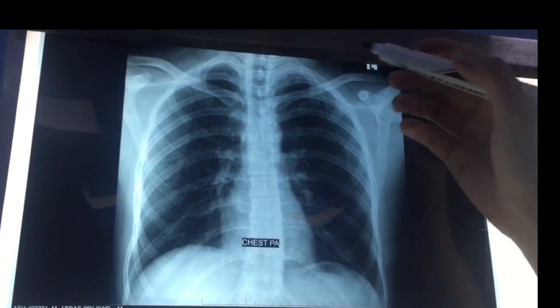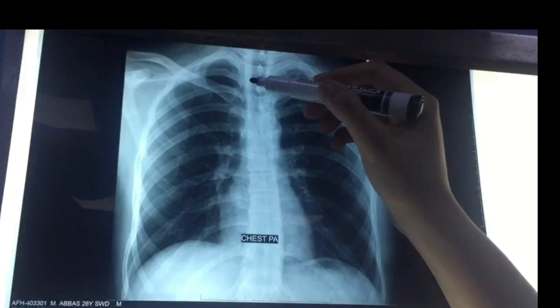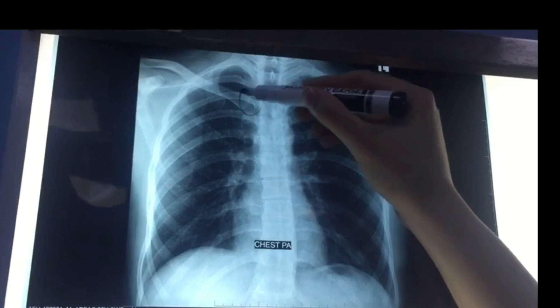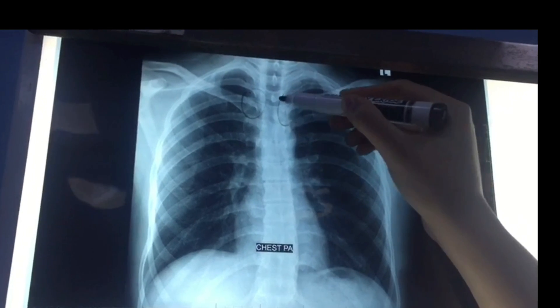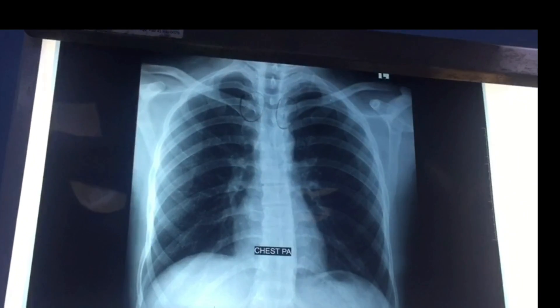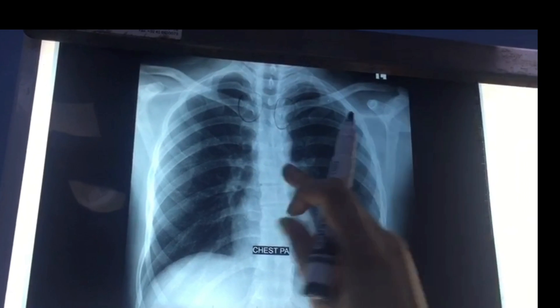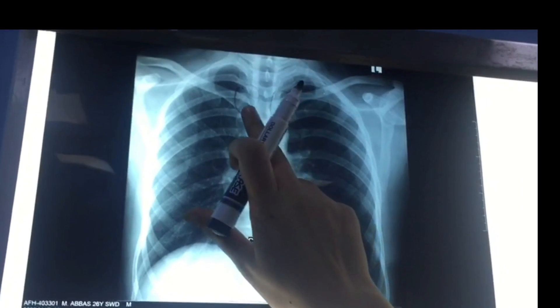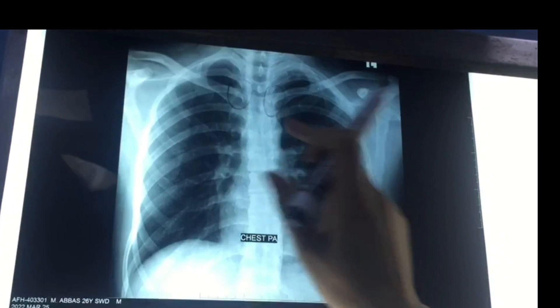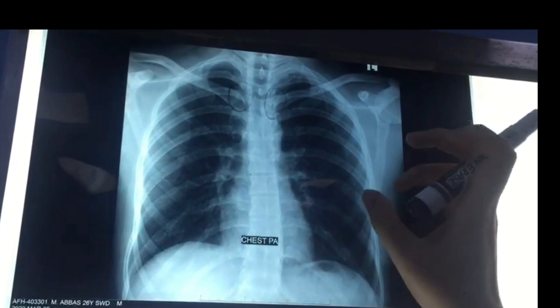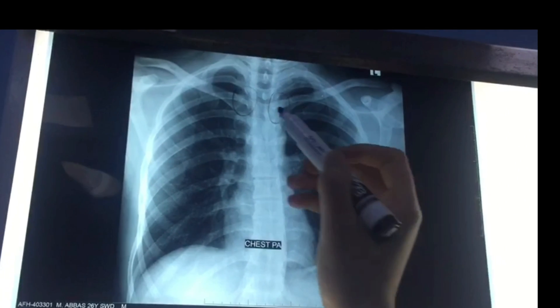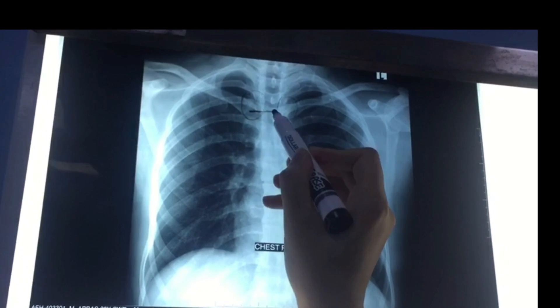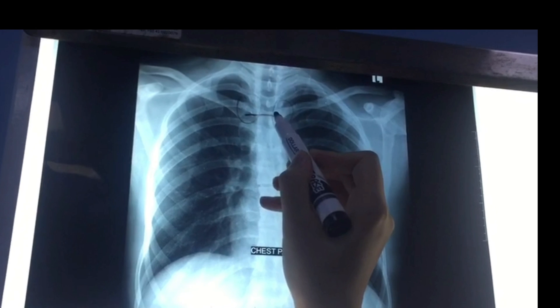The third step is to check the rotation of the film. For this, we will look at the medial end of the clavicle — they should be equidistant from the adjacent spinous process. As you can see, the film is non-rotated.